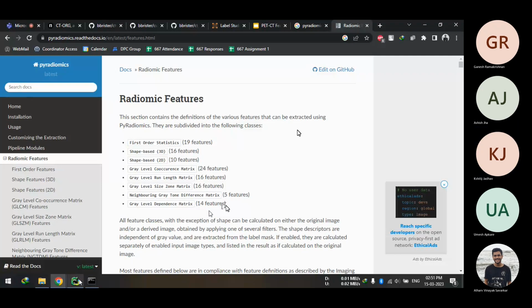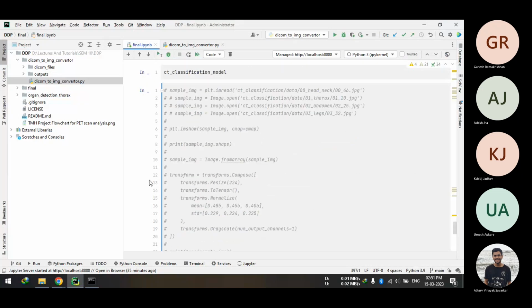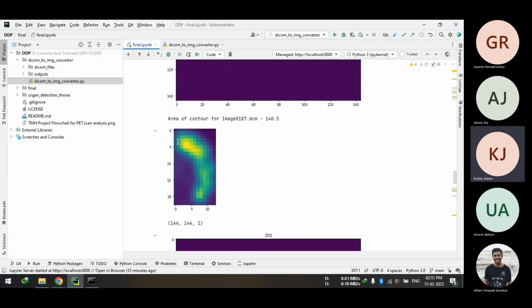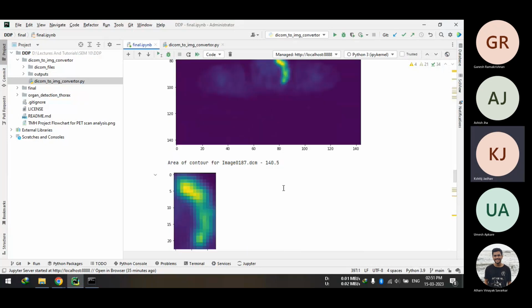Atharva, is it okay? No, I had a doubt right now. Actually, the code to contour the tumor is already done. But you don't have a way to do the entire stitching up with the adjacent slices. That code is also there. So now I had a question: why are we doing this organ detection? Because we don't know which organ it is, right? Then we don't require the complete contour of the organ. Is it important which organ it is?